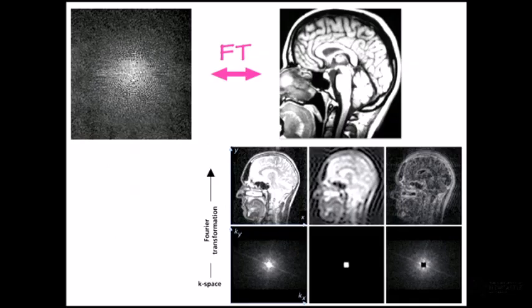And we unravel that frequency information to give us an image. And this is what it looks like. If you could make a picture of what K-space looks like, that's what it looks like. It's all about frequency domains. We apply a Fourier transform directly to this K-space, and that's what we get, our image.